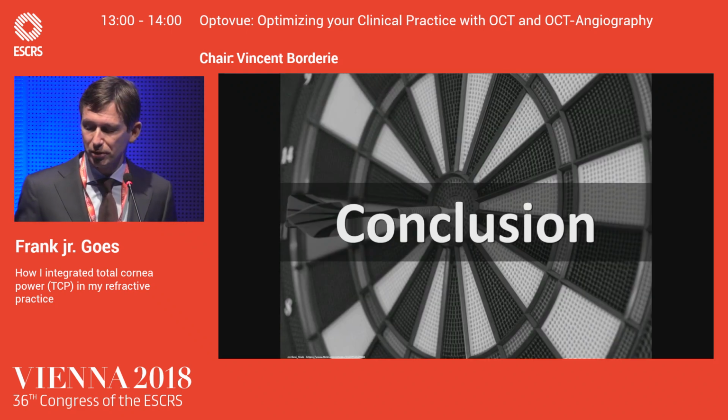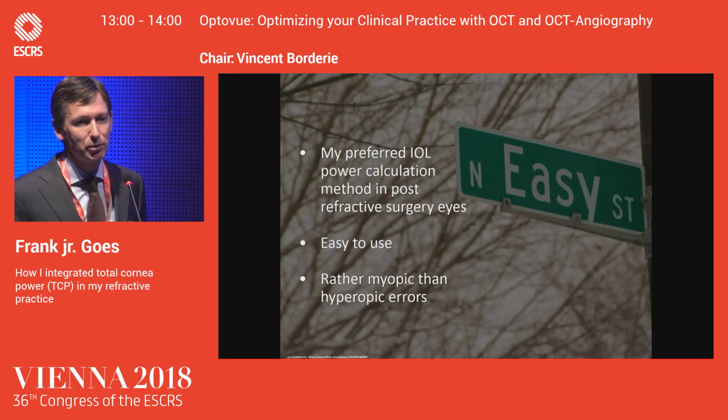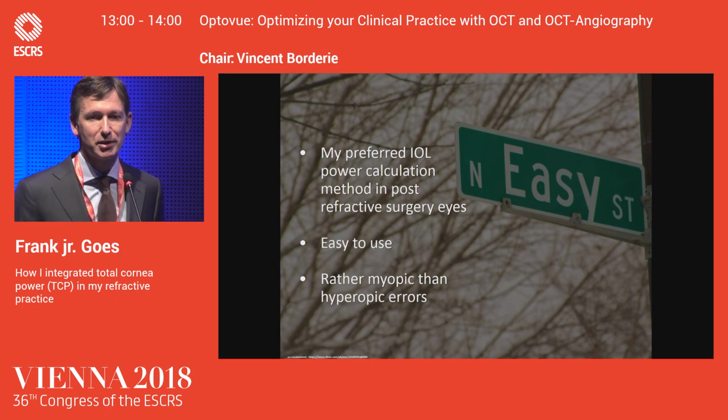So in conclusion, the OCT method that we use has become our preferred IOL calculation method after previous refractive surgery.